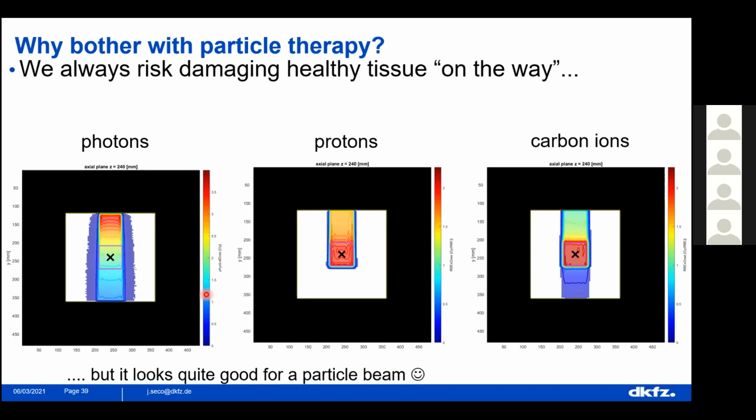Here is the same from a 2D dose distribution. You see the photon curve produces dose all the way through. The protons have this dose here that ends at the distal part. And you have this fragmentation tail here producing additional dose. And this is just physical dose, but when you do carbon ions, you really have to account for this biological effect in this end of range, in this fragmentation tail.